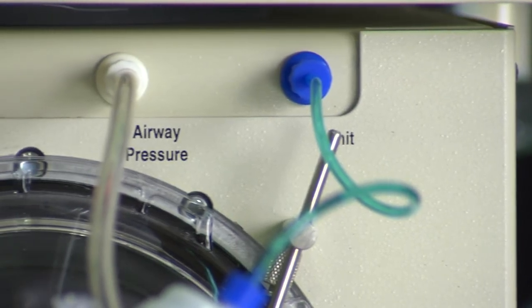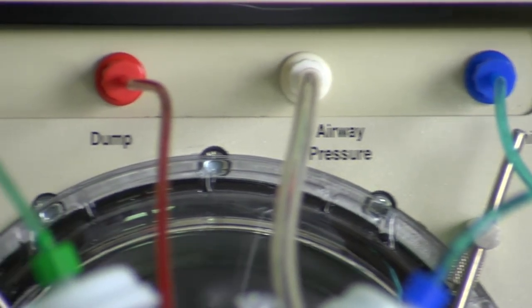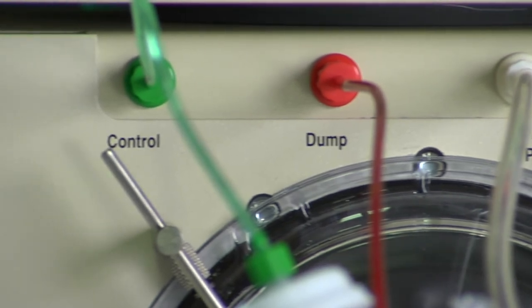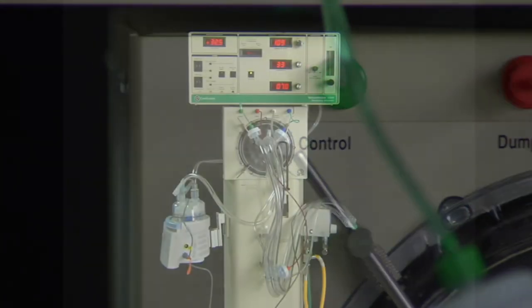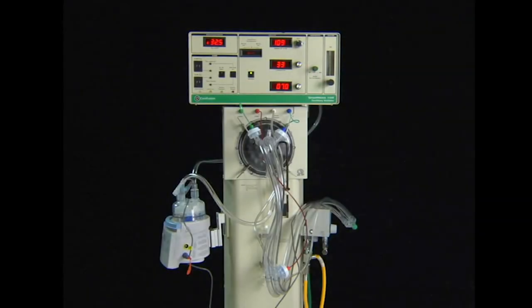The 3100A and 3100B are very simple devices. These are essentially large CPAP generators with a piston diaphragm oscillator attached. This system allows the 3100 to gently inflate the lungs while superimposing oscillations to ventilate the patient.